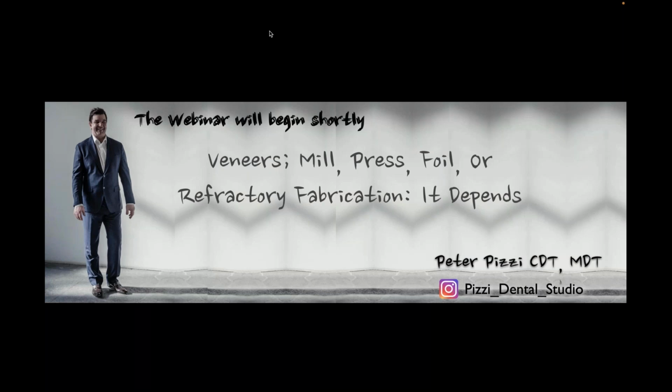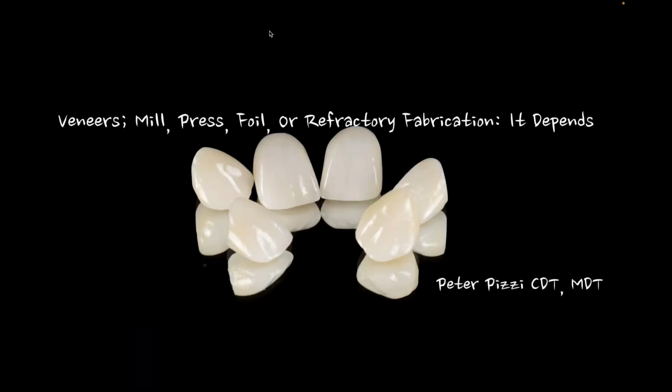Well, as usual, interesting topics, lots of different things to talk through and work through. I do a lot of veneers, so actually, it was last night as I was putting stuff together. I think I had about 200 slides in here, and I've been cutting them out all morning, trying to make more of a point out of it.